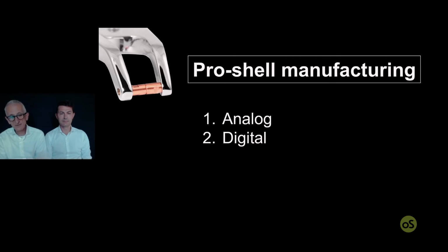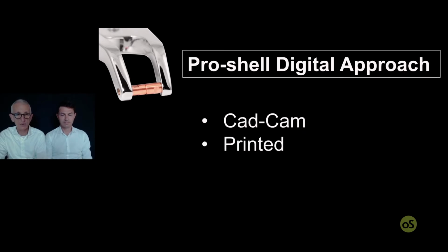We have seen in the previous lecture the construction of the analog shells, and today we will see the same steps for the making of a digital shell.